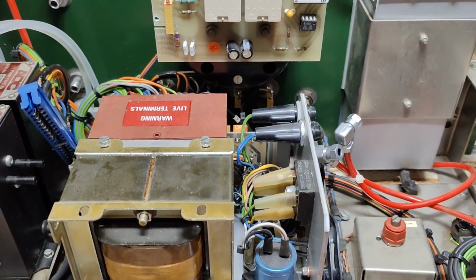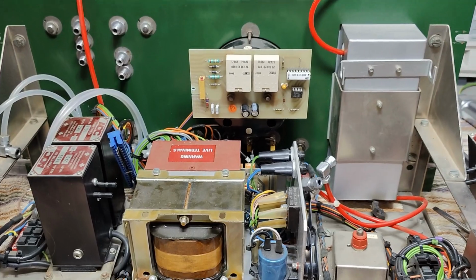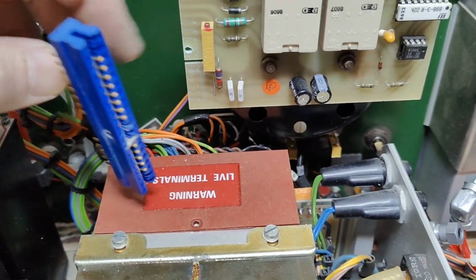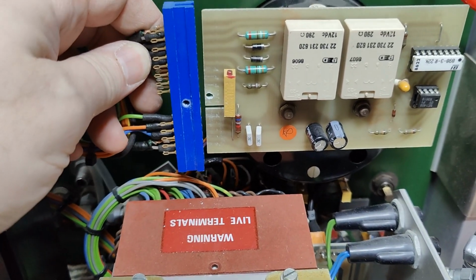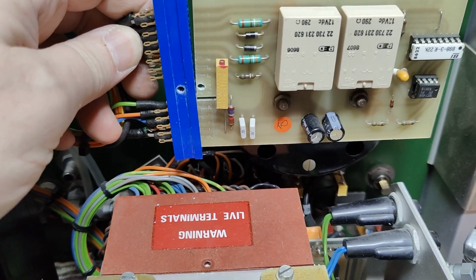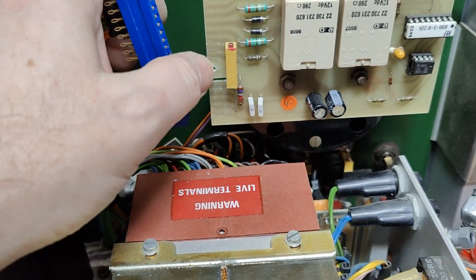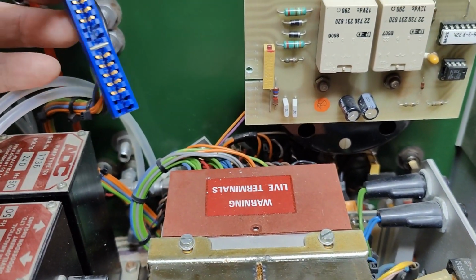There's another little funny thing that I found. See, here's the circuit board that drives the meter. Look at that screw, or look at that hole. See, somebody was tired of this falling out. So he drilled a hole here and put in a screw. I think that is a little bit funny, isn't it?